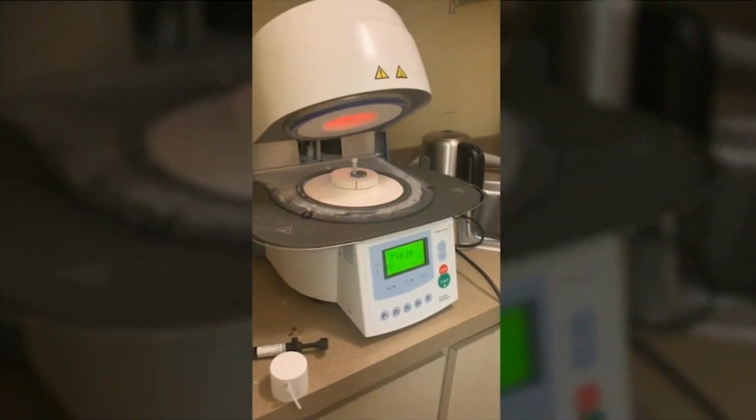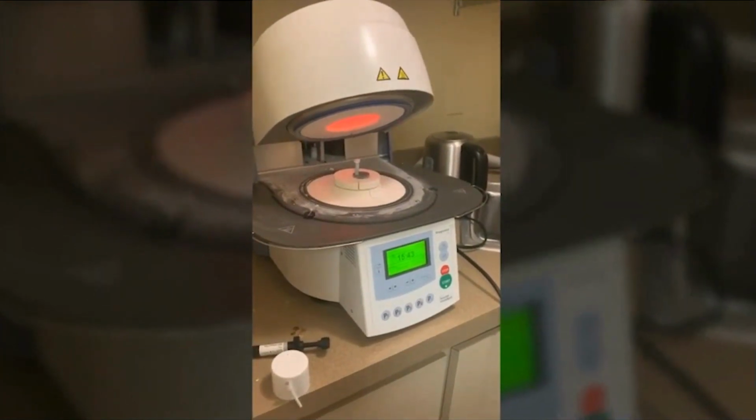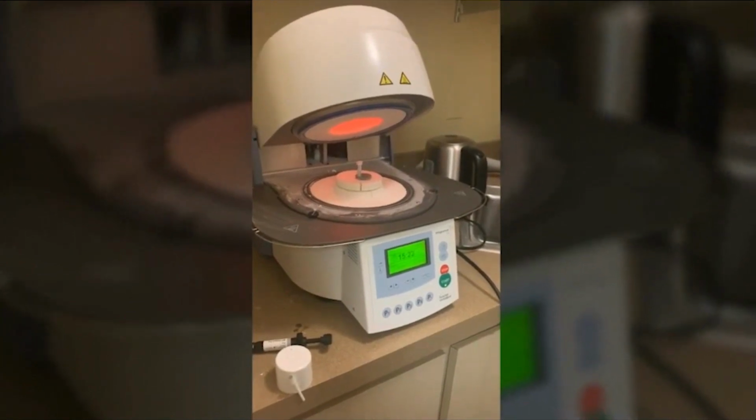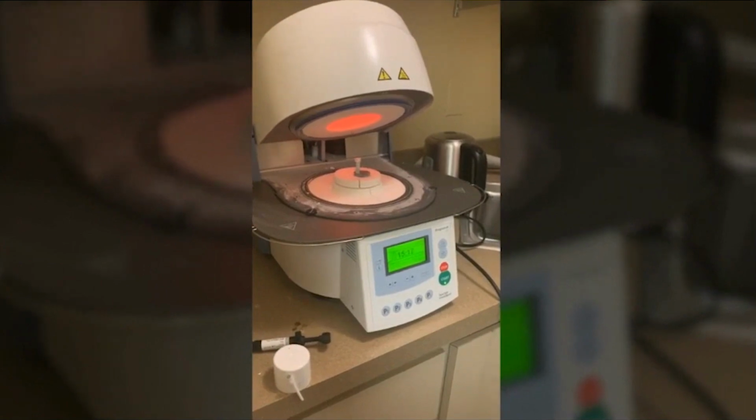There's all settings on the machine on the bottom. You see like five little buttons, and depending on what type of restoration you're using, there's certain settings so you know exactly how long it needs to go in the oven.